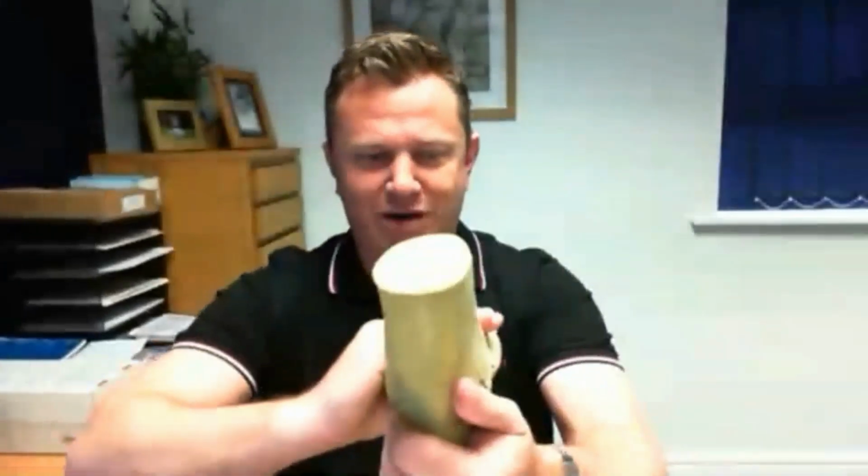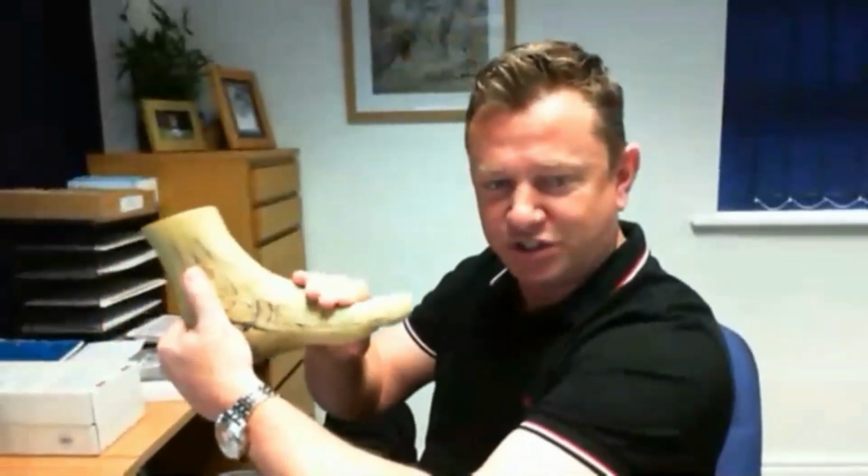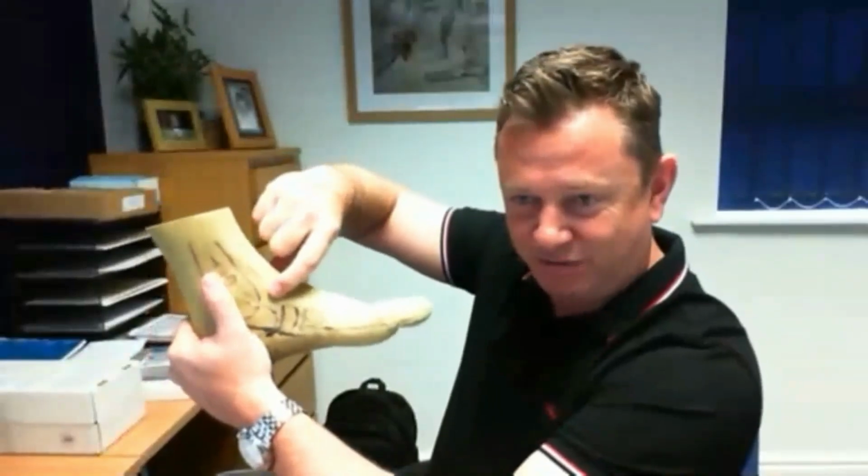So I would go so far as to say this. When I teach my students, and people are going to balk at this, when I was taught to cast an AFO back in the day, you would grab the heel, pull it straight, grab the forefoot, and try to line it up. Now, that's how a lot of people are taught to cast an AFO. How the hell at the same time you palpate through plaster or a casting material to know if you're in subtalar neutral is an absolute mystery. And anyone says that they can do it, I guarantee you can't.